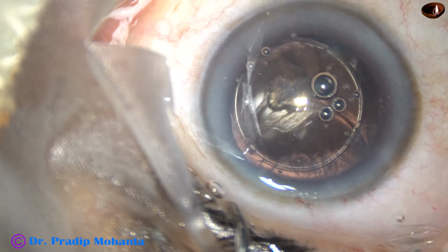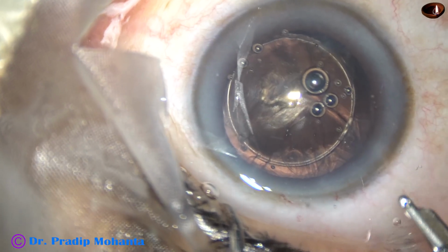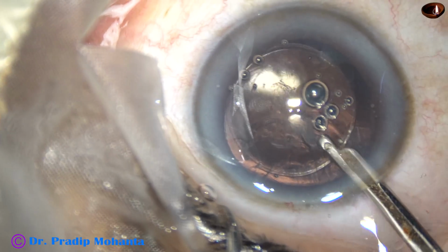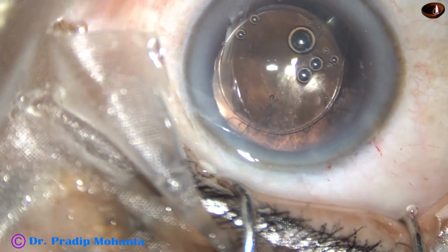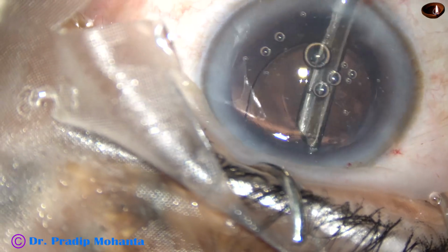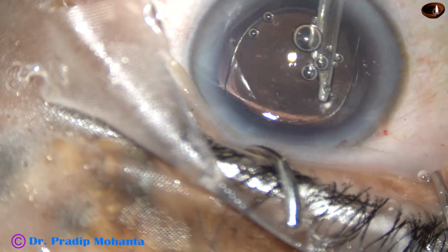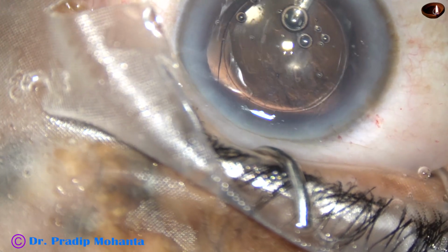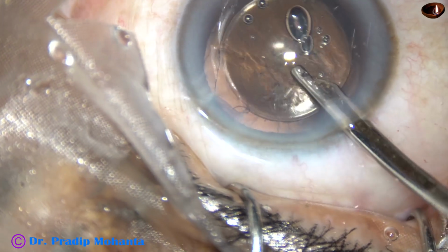Still, I am doing a dry aspiration to make sure that I don't hydrate the vitreous. And now I made a side port at 7 o'clock, and through that side port I am removing the cortex from 10 o'clock to 1 o'clock.